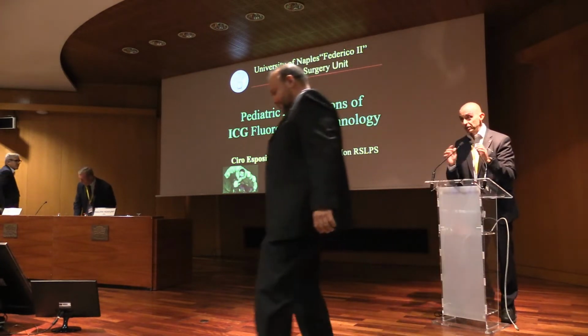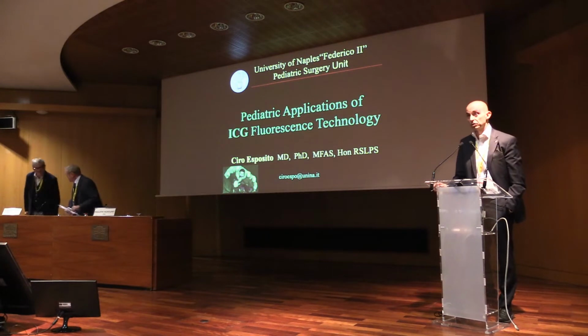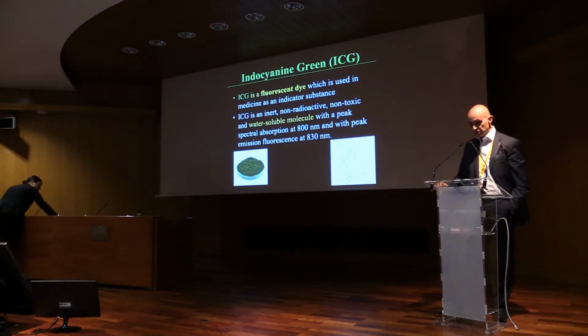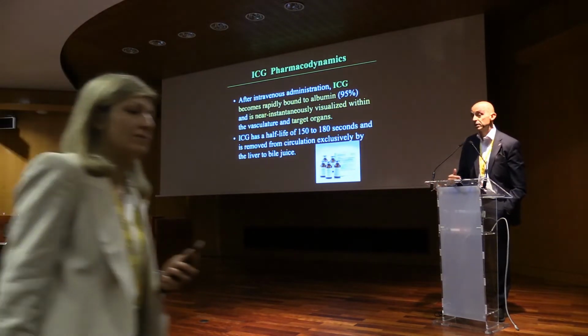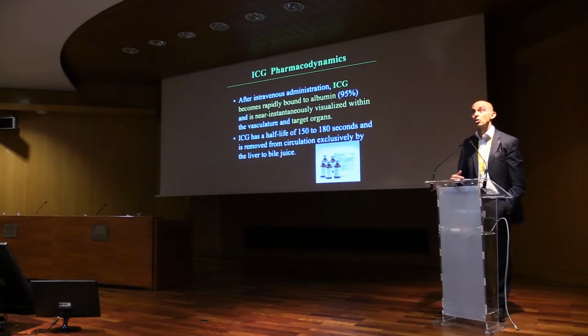Thank you very much, Mario. Thank you very much, the ESPES Executive Board, for the invitation to give this lecture on pediatric applications of ICG fluorescence technology. As you know, ICG is a fluorescence dye and a water-soluble molecule. As for pharmacodynamics, ICG is rapidly bound to albumin and near instantaneously visualizes target organs, which can be GI or renal or other structures. I will show you in my slides.